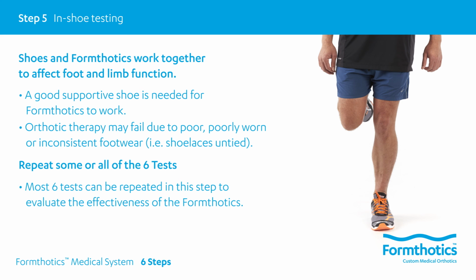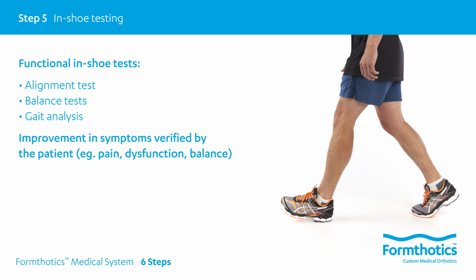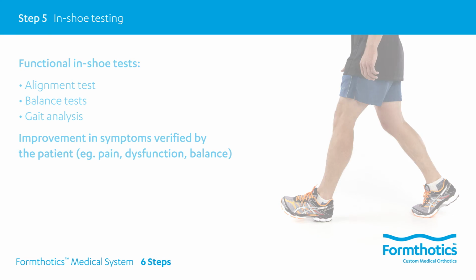Most of the 6 tests can be repeated in this step to evaluate the effectiveness of the Formthotics. Good functional in-shoe tests include the alignment test, balance tests, and gait tests. The improvement in symptoms should be verified by the patient, e.g., pain, dysfunction, balance.